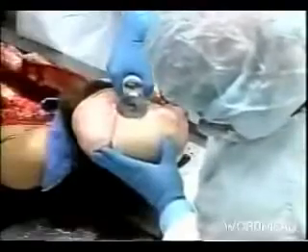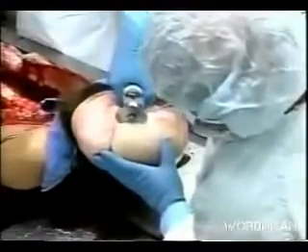Okay, he's now reflecting the scalp. The front has been done. Now he'll reflect the posterior portion. Now that all of the incisions have been made, he'll use the key in order to free it up and peel it off from the dura. And as you can see, now the brain has been exposed.